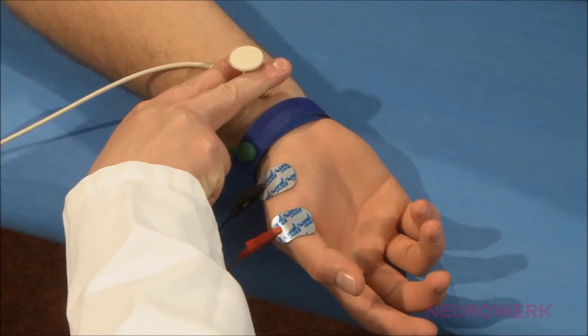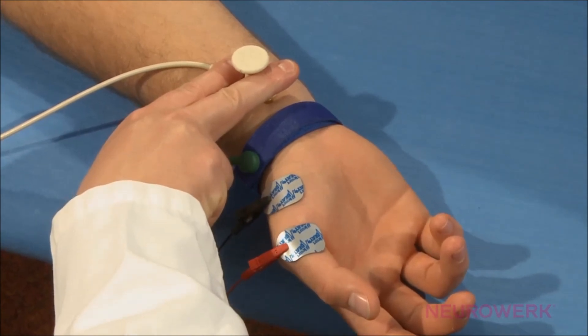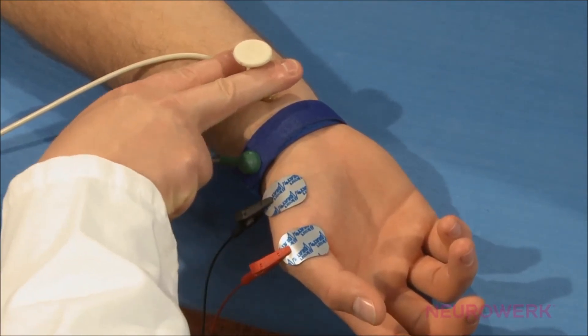Firstly, the median nerve is stimulated distally, directly behind the wrist. The cathode — the so-called minus electrode — is located distally, meaning it is directed toward the target muscle.